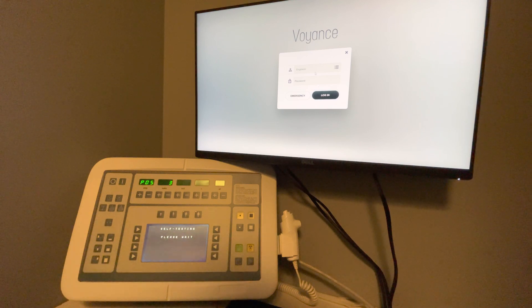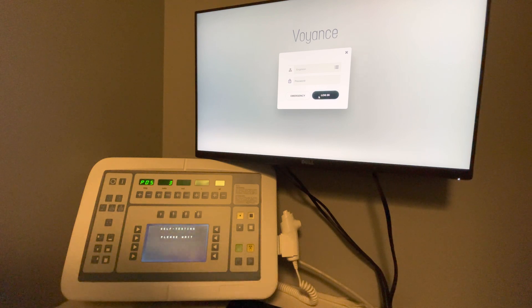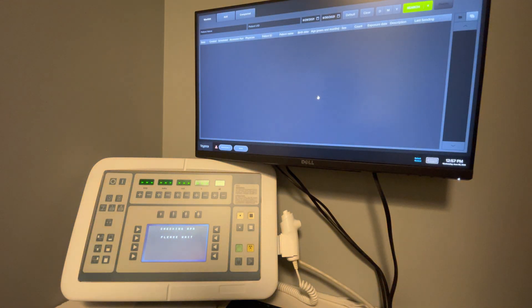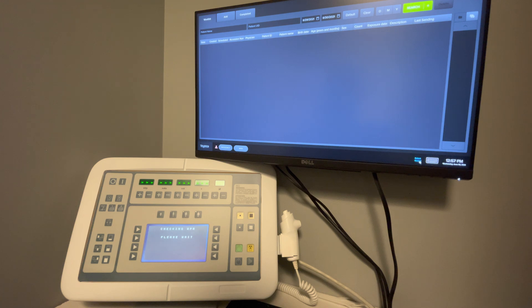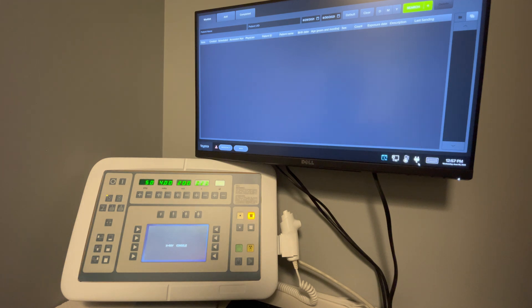To log in to the Voyance software, you just click on the login button and it will take you to the first screen. You're going to want to make sure that the DR panel is connected, so we can click on the DR panel sensor here and wake that up if it's not already on. We can see here that it's connected, normal temperature, and it is plugged in.